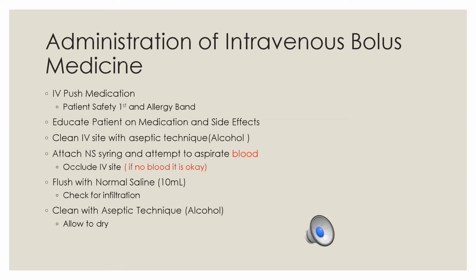You want to attach a normal saline syringe and attempt to aspirate blood. If you do not see blood, that's okay. It doesn't mean anything. But if you get blood, you definitely know you're in the vein.